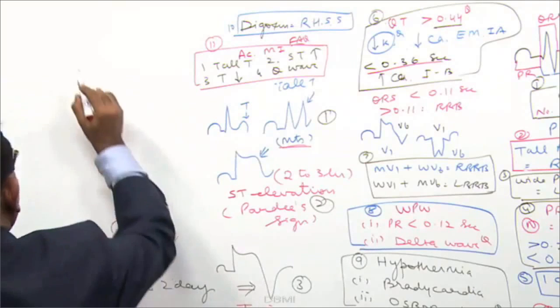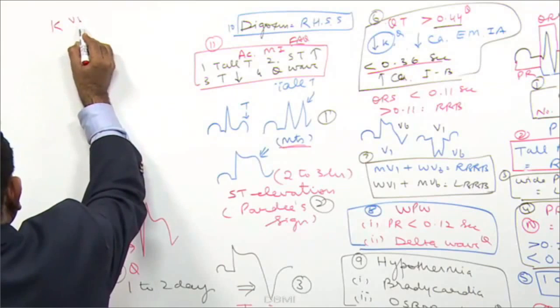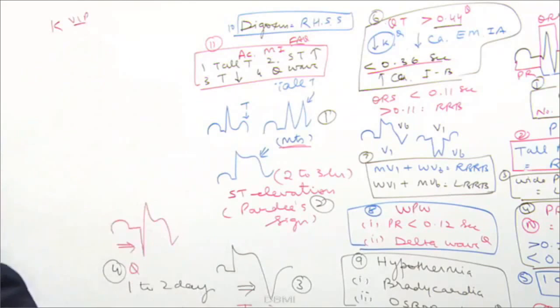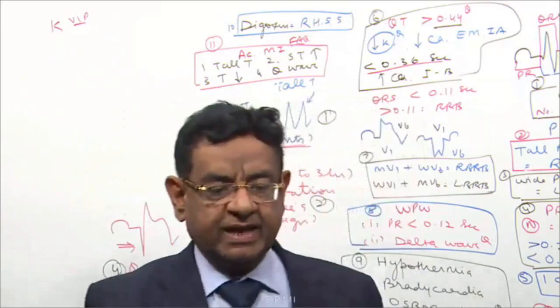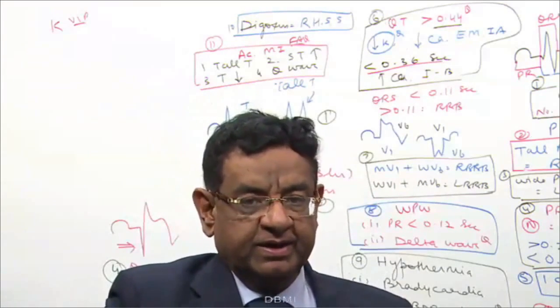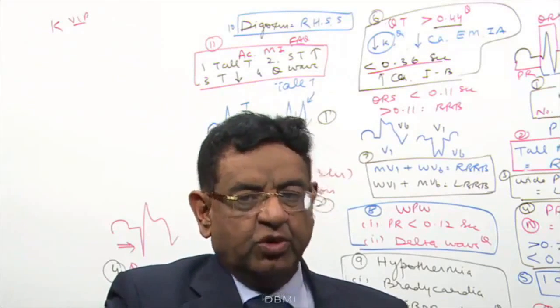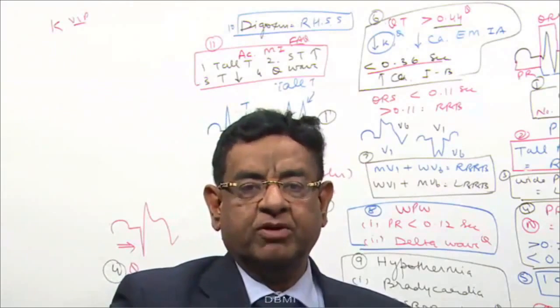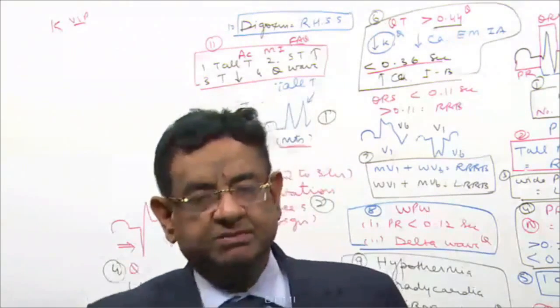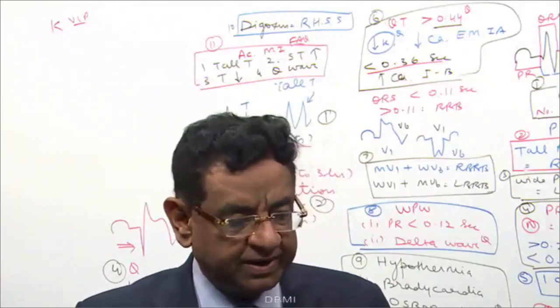Now we talk about potassium. Potassium is a VVIP topic. This question always comes throughout the world. Friends, whichever exam you appear in, Indian PGs, PLAB, MRCP, etc., you always get a question on potassium. Maybe hyper or hypokalemia cause, symptom or treatment or ECG finding. But at the moment, I'll talk only about ECG finding.